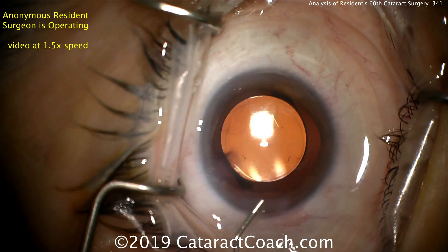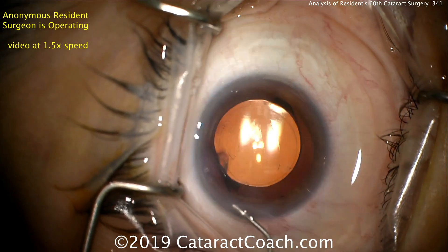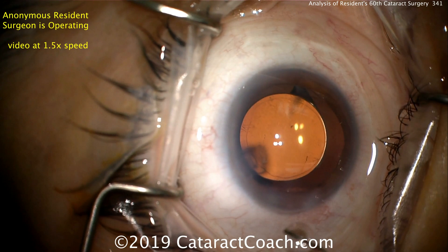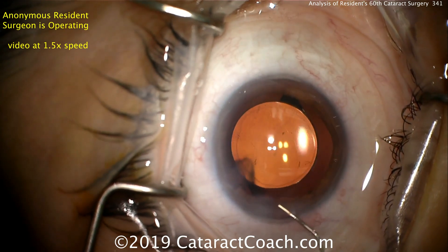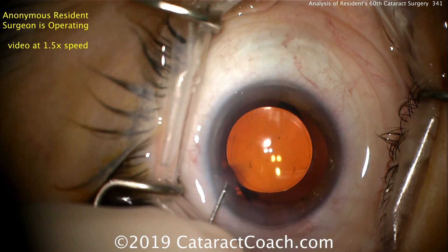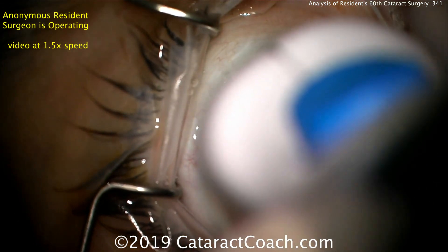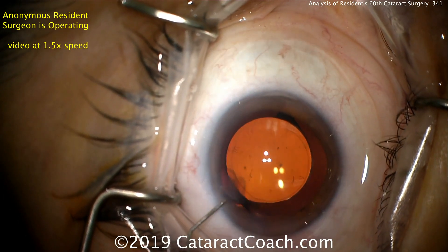And finally, let's hydrate the incision — a little bit of hydration each direction. That incision actually looks great. So despite the sawing technique, which I'm not a big fan of, the incision looks well-constructed and is sealing quite nicely. That paracentesis looks a little bit on the long side. Overall, this is an excellent case — this resident is doing great for having done only 60 cataracts. The take-home message: make sure the resident learns a good nucleofracture technique and aims to learn phaco chop in the next 50 to 100 cases. A Weck-Cel sponge to check the incisions — those look good.